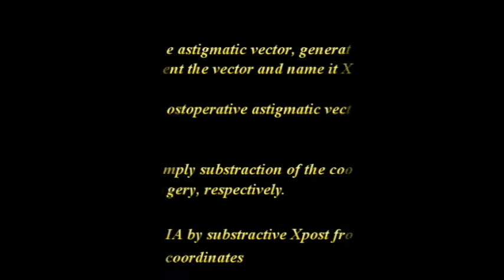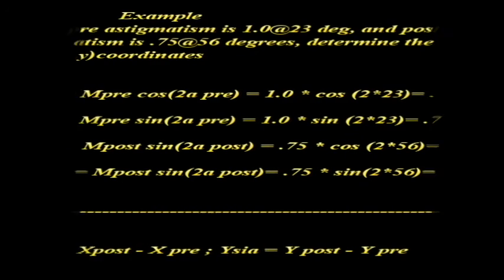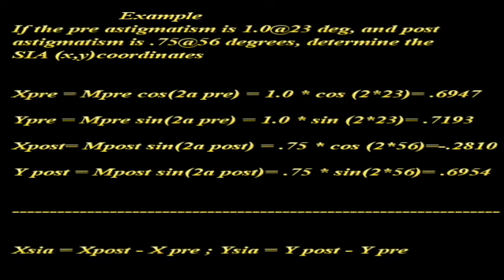So let's take another example. For example, you have astigmatic data, and from there you get x and y preoperative coordinates, and x and y postoperative coordinates.